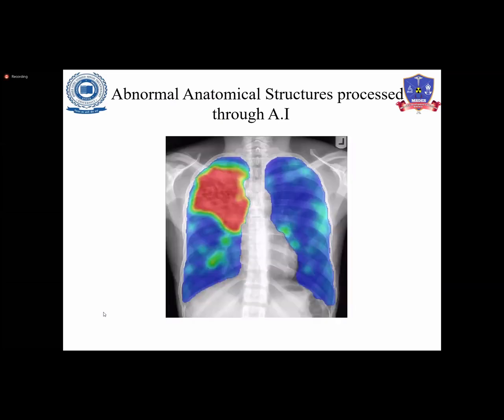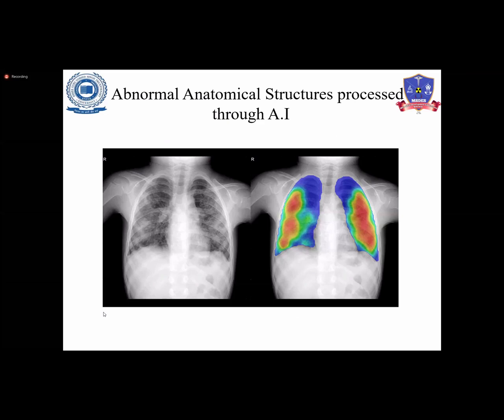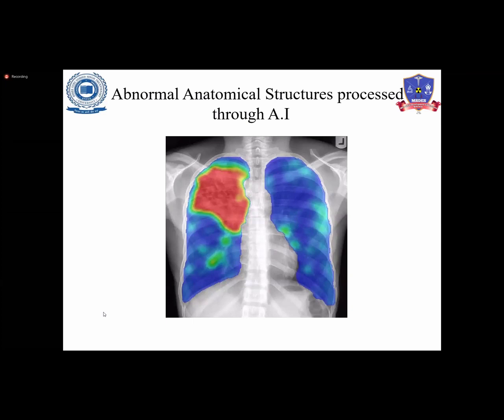If we feed the data properly into each and every pre-data set, then we can process the data. Suppose we mark the chest PA only with these different kinds of color coding in the data set, and once we enter a new X-ray into the system, we will get the abnormal and normal result accordingly. Then the second example, where we mark different pathologies in different colors, with different patterns.